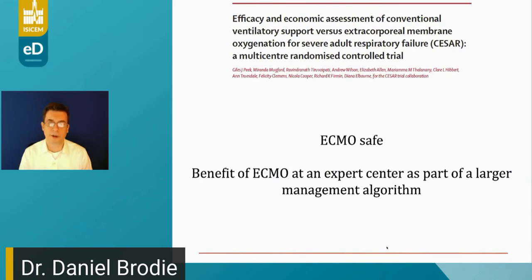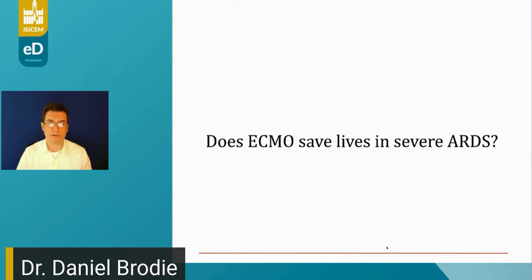What the CESAR trial did show us is that ECMO is relatively safe, and that there appears to be a benefit of ECMO when performed at an expert center like Glenfield Hospital as part of a larger management algorithm for managing patients with acute respiratory failure.